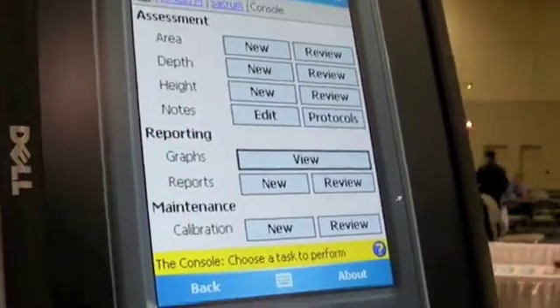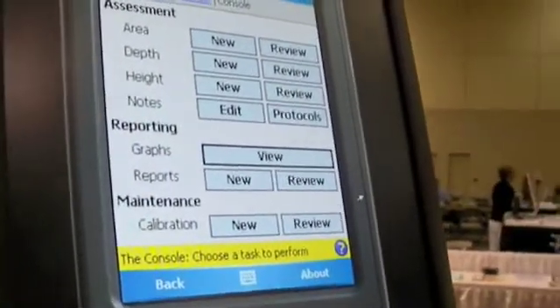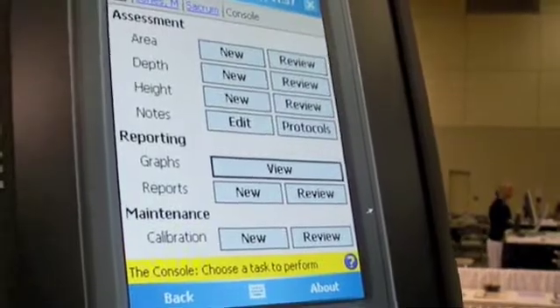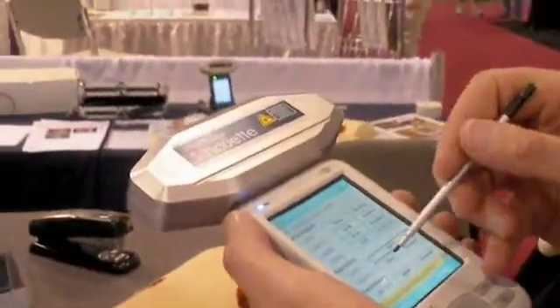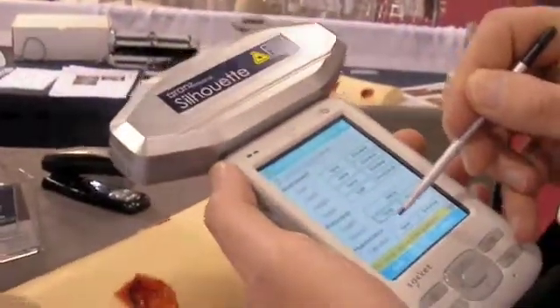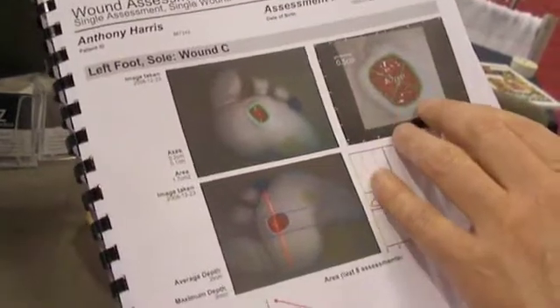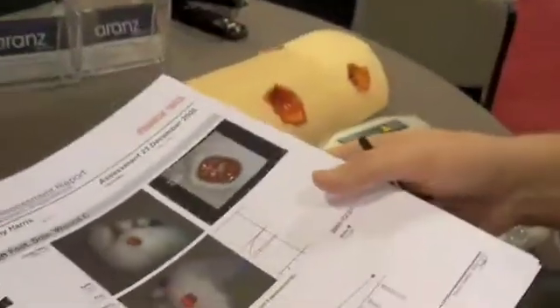The US price is $6,500 USD. The next step is we can generate a PDF report by pushing this button here. Here's a sample — it pulls in the area image, the surface area measurement, depth and depth profile, and the graph of changes over time. The system is also able to input notes about the wound, and these are all tabulated and combined into the report.